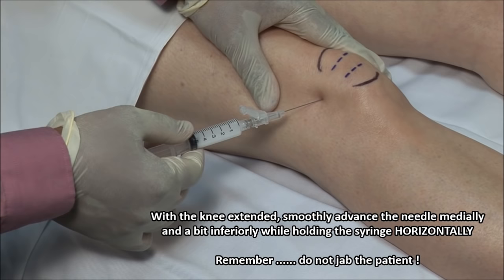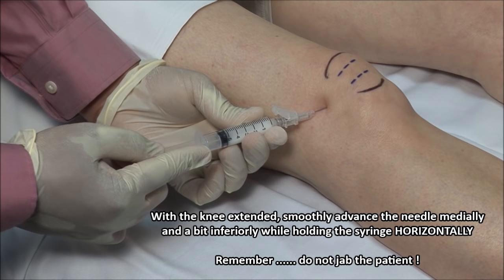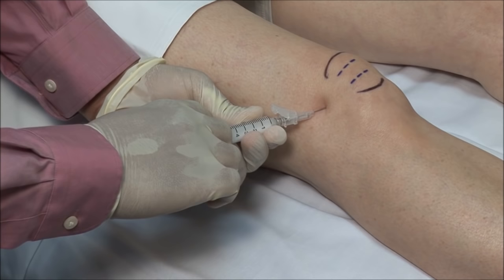If bone is encountered, you should redirect the needle. You will feel a give as the needle breaches the joint capsule. Always aspirate to ensure that you're not in a blood vessel, and then inject the solution.